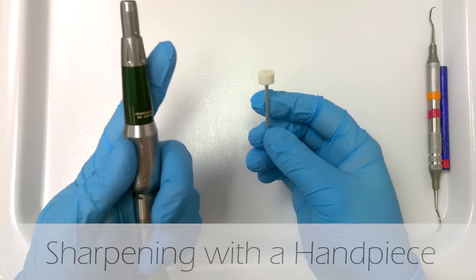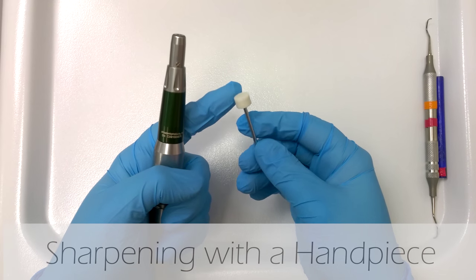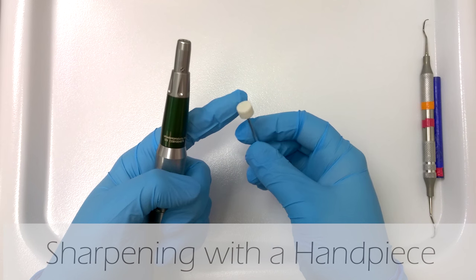I'm going to show you how to use a slow speed handpiece to sharpen your instrument. So this is a special attachment with a sharpening stone on it.